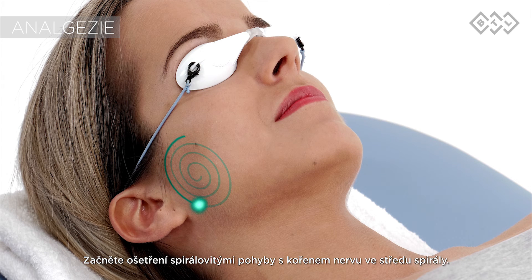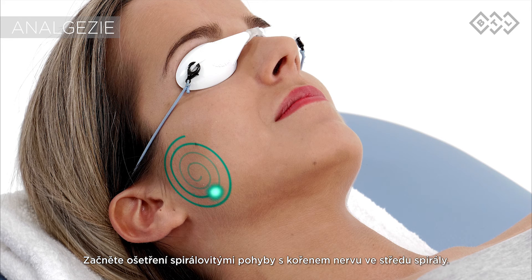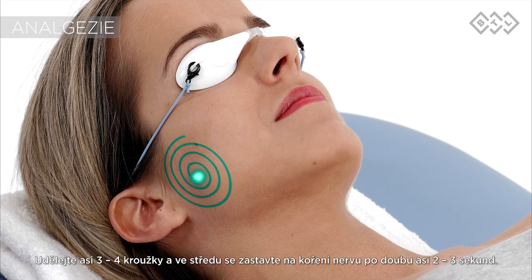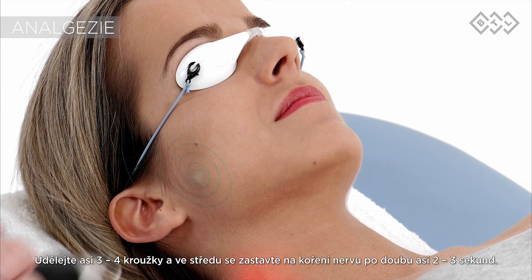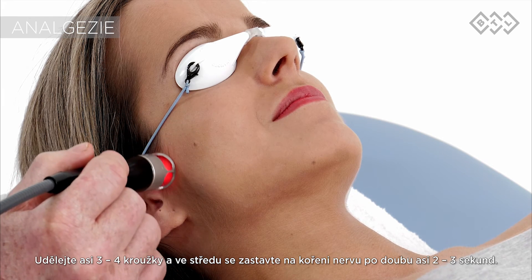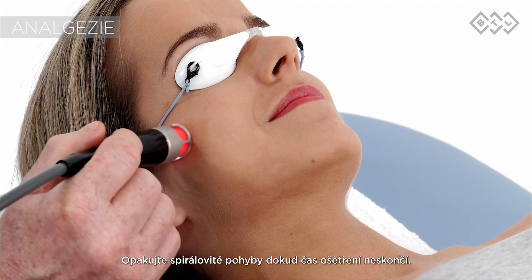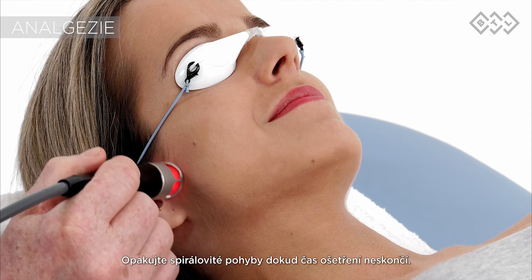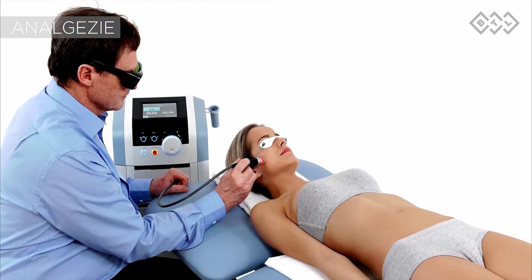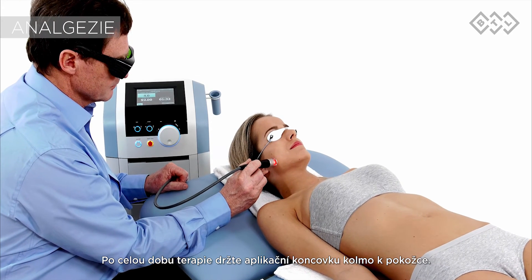Start the therapy creating a spiral motion with the root of the nerve in the center. Create about 3 to 4 loops, and when in the center, rest above the root for about 2 to 3 seconds. Repeat the spiral motion until the therapy time is up. Keep the applicator perpendicular to the skin.